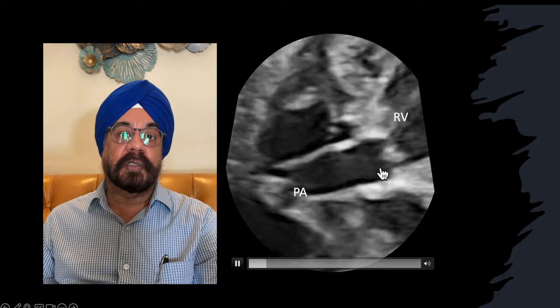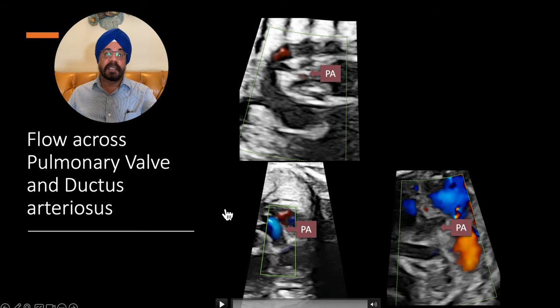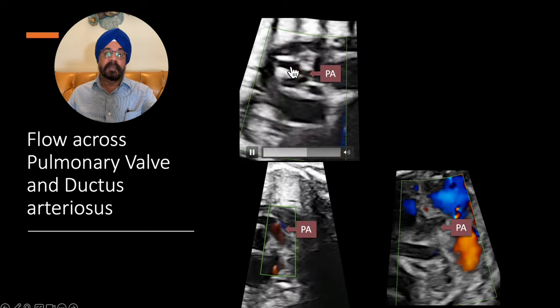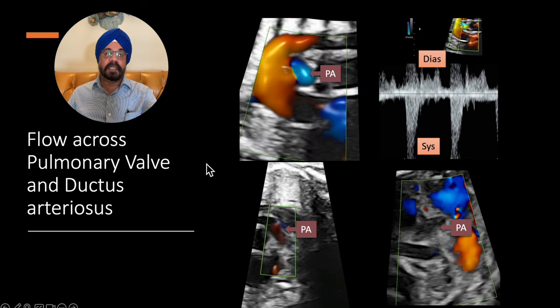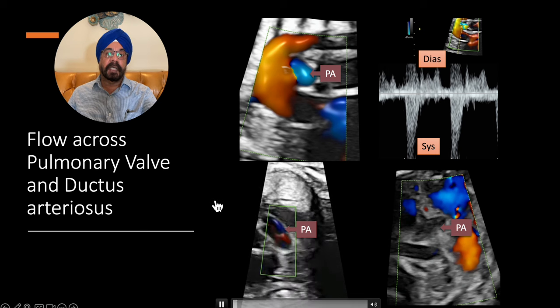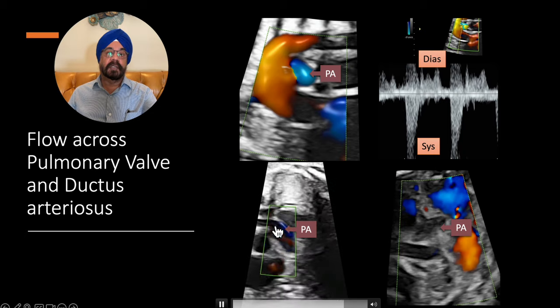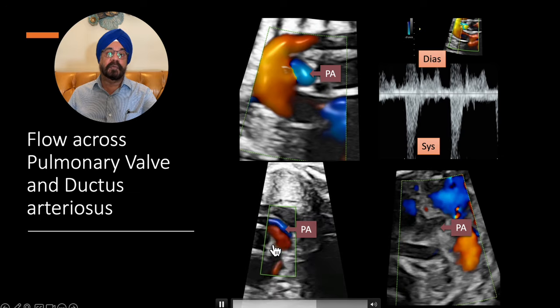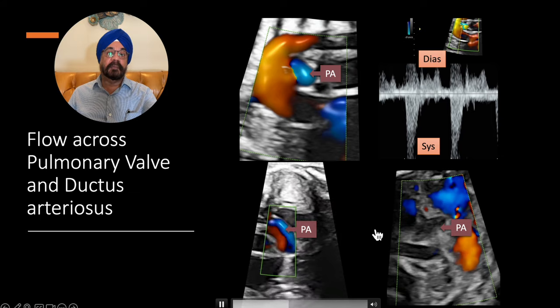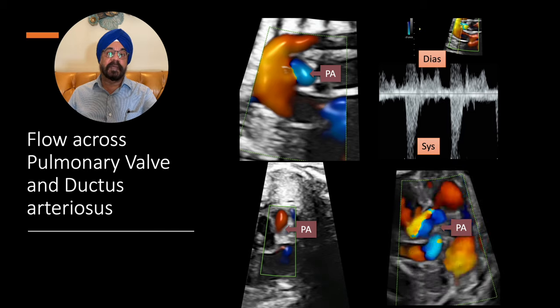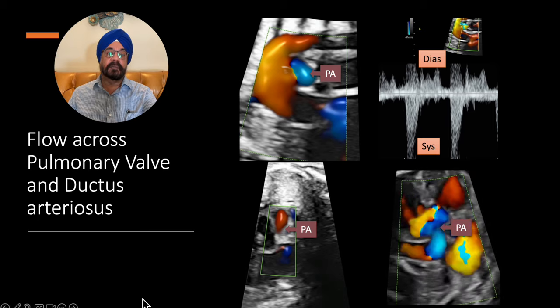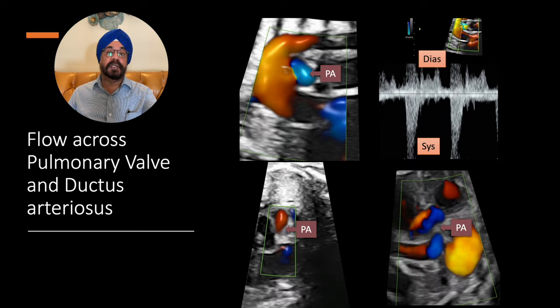The pulmonary valve finding is an important prognostic sign. Looking at the ductus, there is ductal flow reversal, predominantly occurring in systole with some small forward flow in diastole. In the proximal pulmonary artery, there is bidirectional flow because there is only a very small forward flow across the pulmonary valve from the right ventricle, with the rest being reverse flow from the ductus arteriosus — indicating reduced pulmonary forward flow.